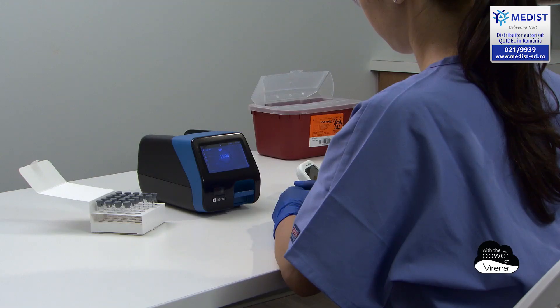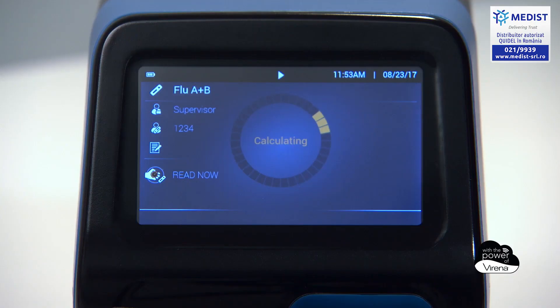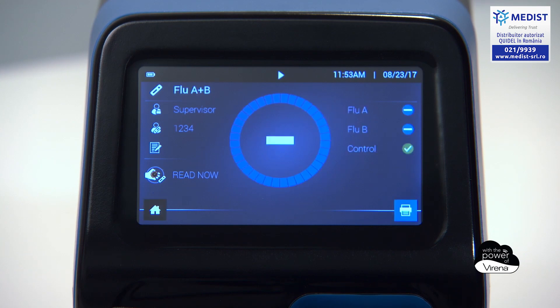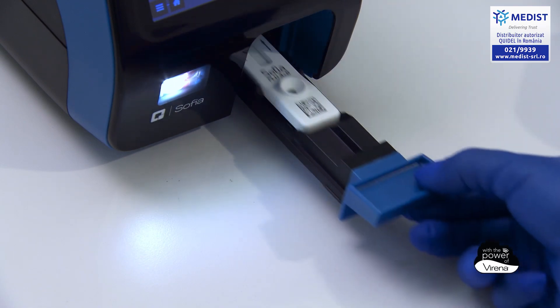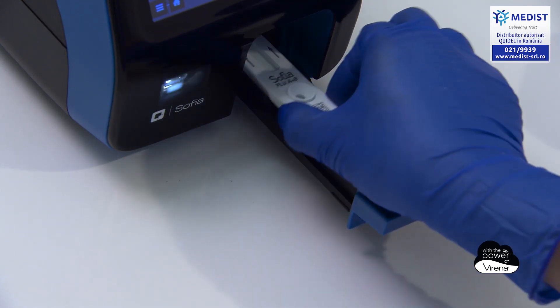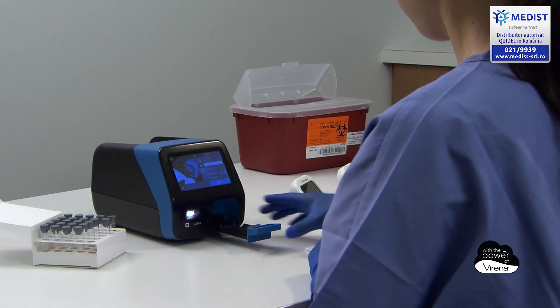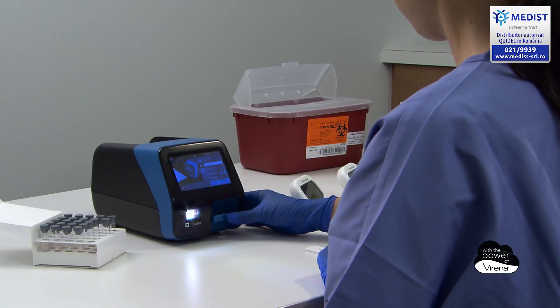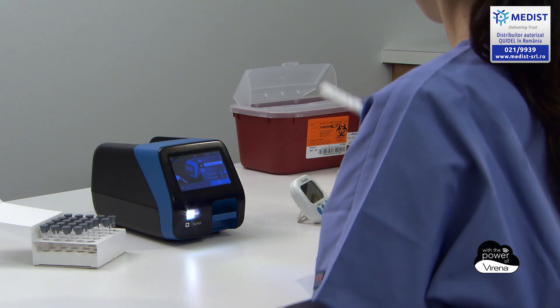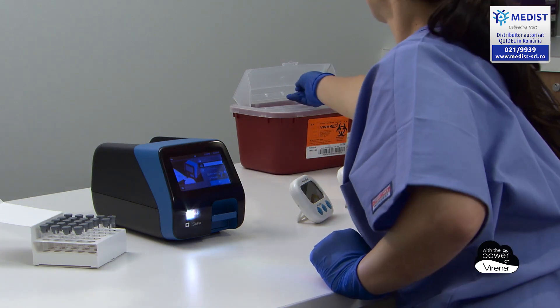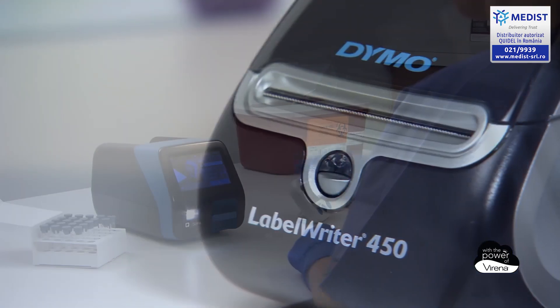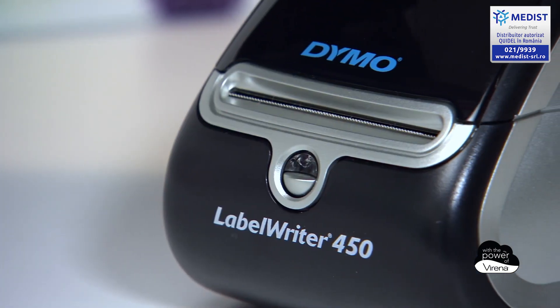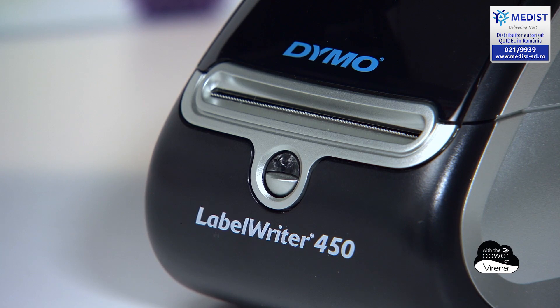When the test is complete, the result screen appears and informs the user if the test was positive, negative, or invalid. The result is saved automatically to Sophia2's onboard data management system and can be recalled on Sophia2 and, if desired, reprinted using an optional external label printer.